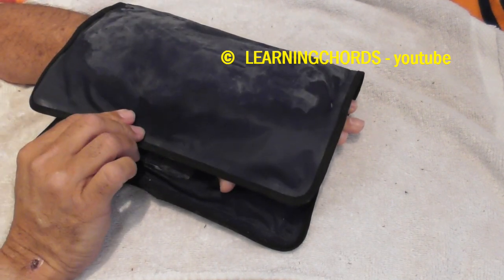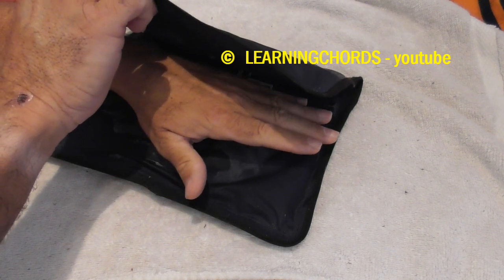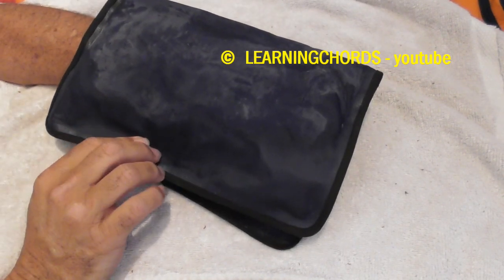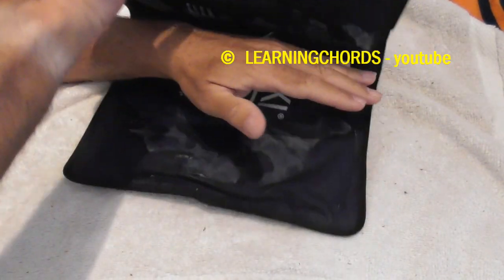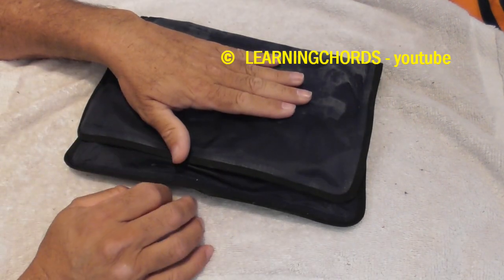As I said, normally I would be putting the towel between you and the ice pack. The towel will get cold, but it will not freeze your hand off and damage the skin. This is ice cold freezing. This is so cold. So you can see I have the ability, depending on which ice pack I buy from them, to put my whole hand in there. I can rest my hand on there if I've injured a finger.